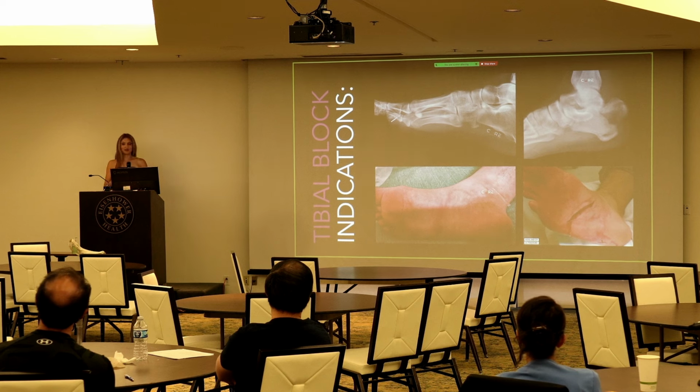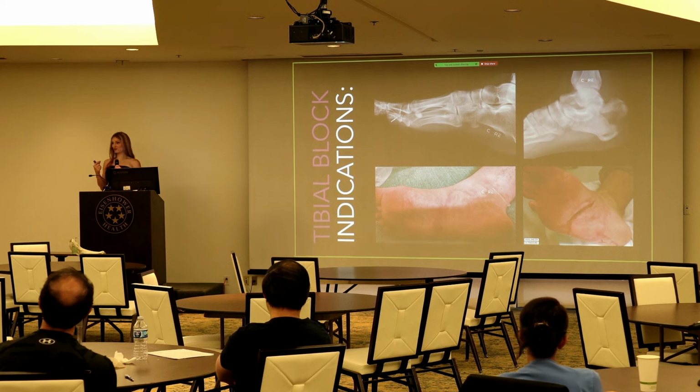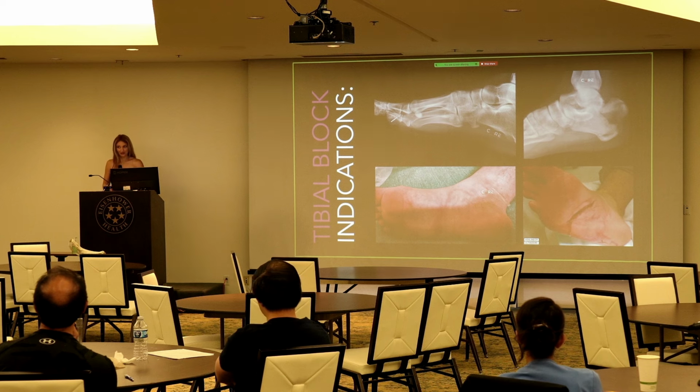We had a lot of barefoot walkers in Kentucky, a lot of children, and I don't know, has anybody tried to anesthetize the plantar surface of the foot? It's never worked for me. I've never been able to do local infiltration and have it work to remove a foreign body from the foot. You do a posterior tibial block, and you're away from the site that's already painful and irritated, and it completely blocks the entire bottom of the foot. You can dig around there as much as you want to, and the patients don't have any pain there.